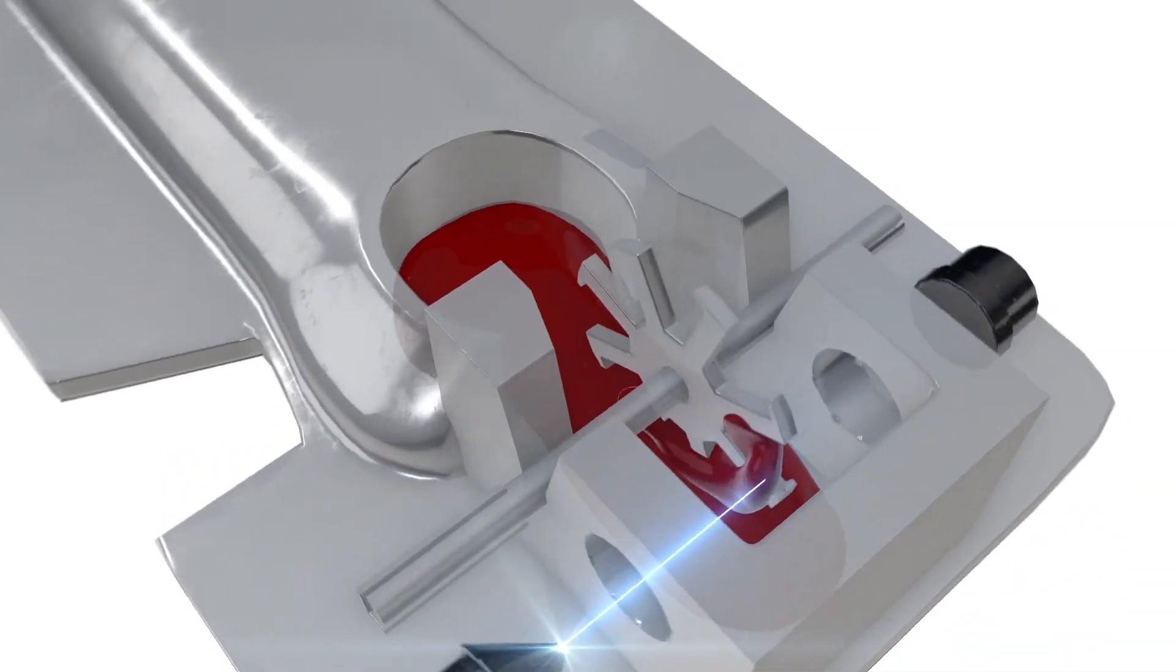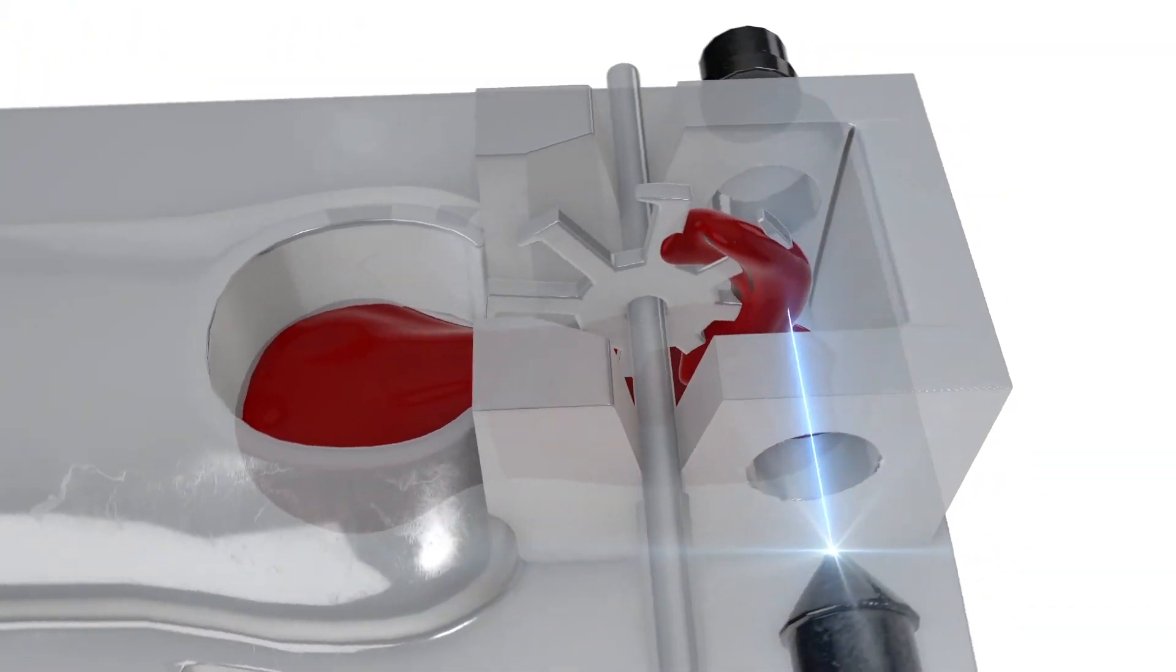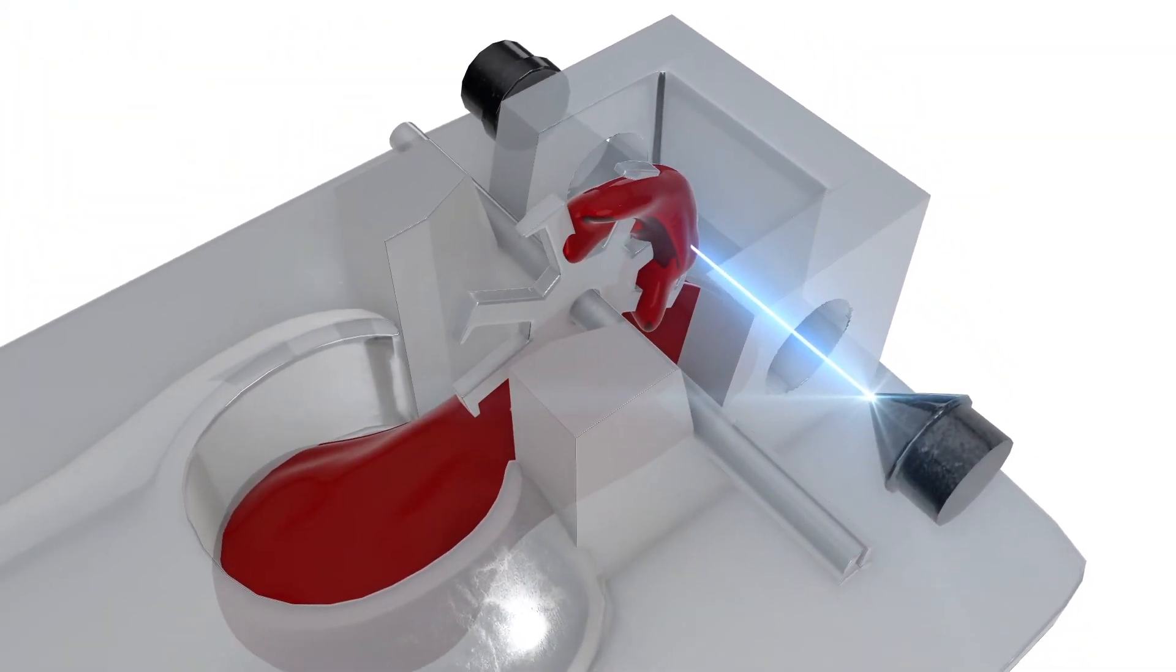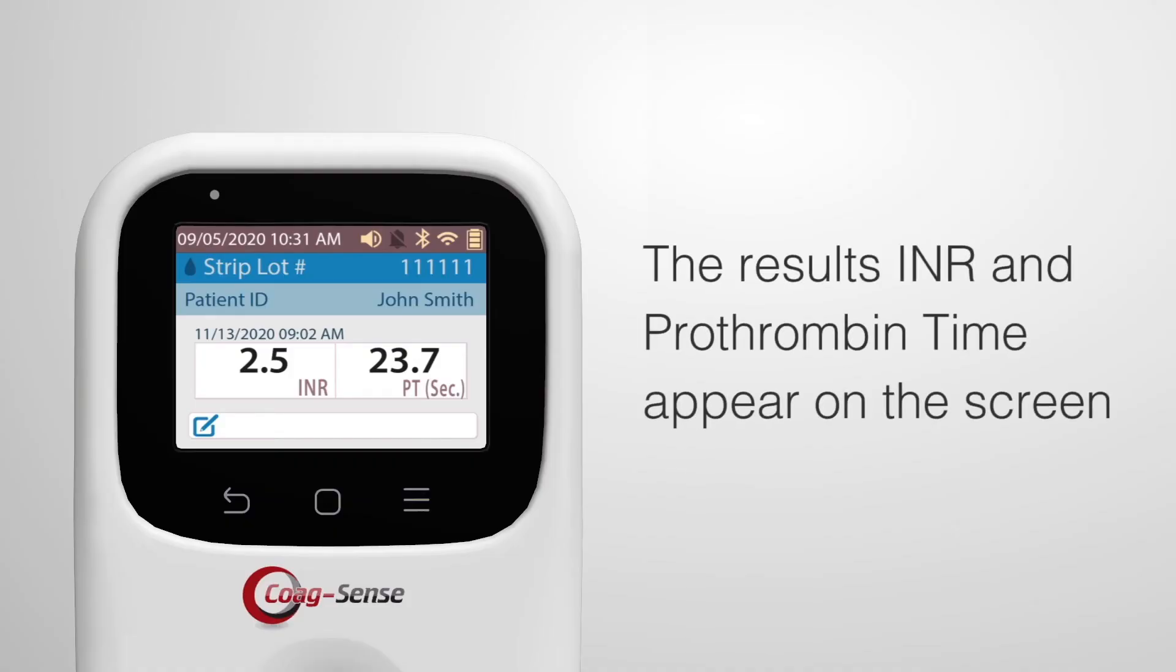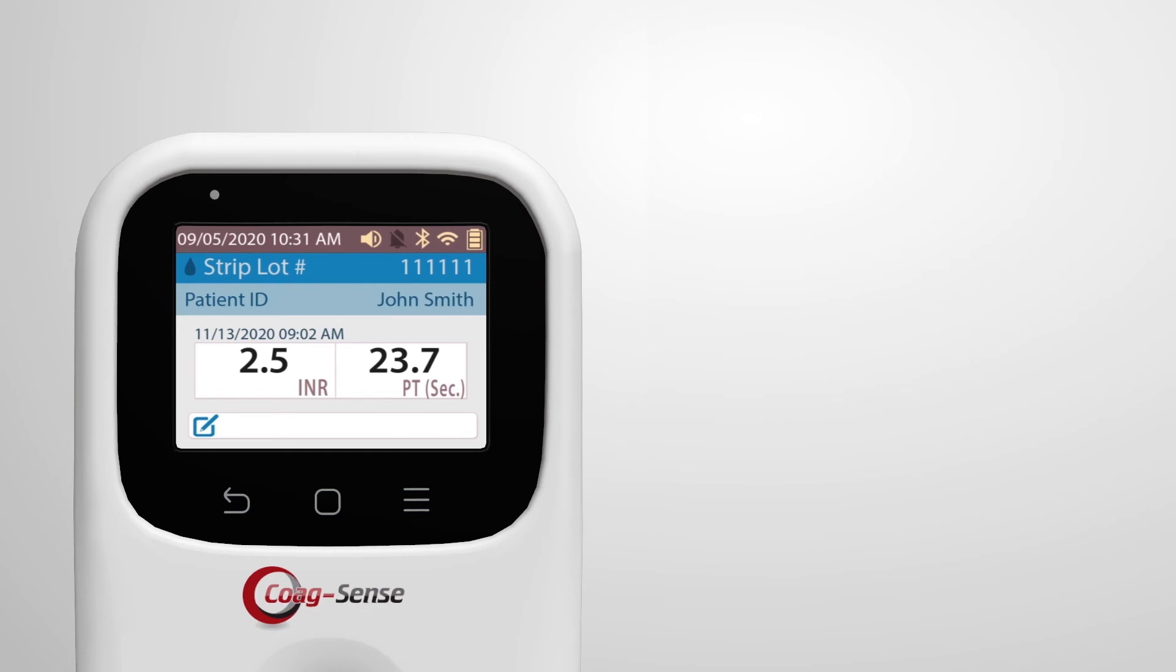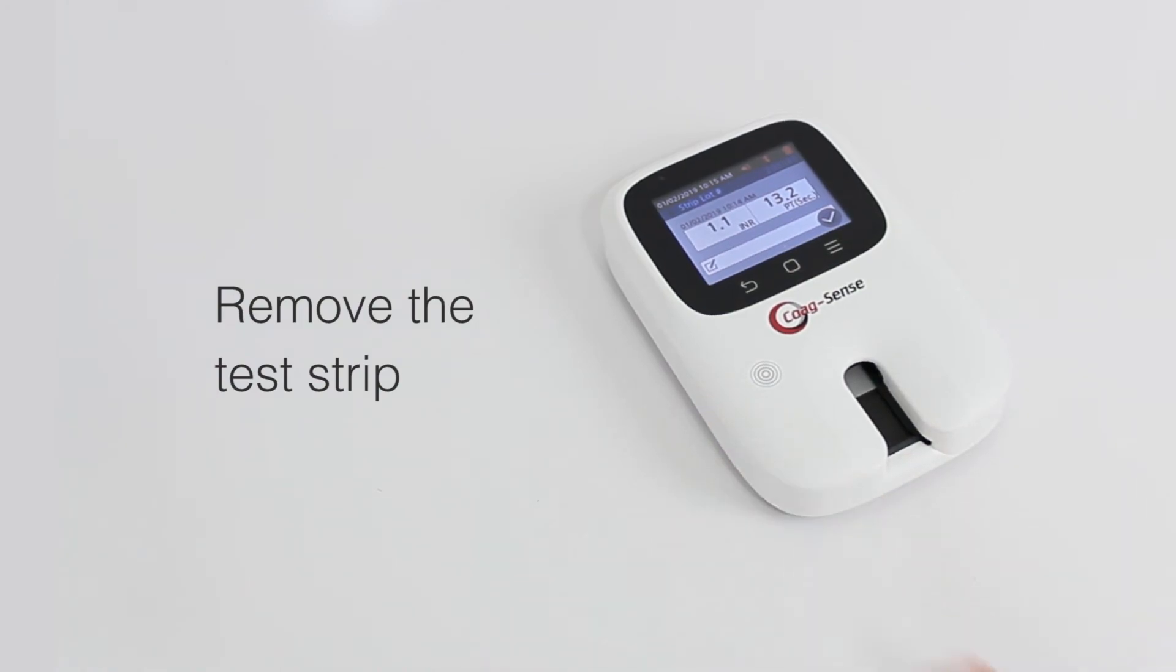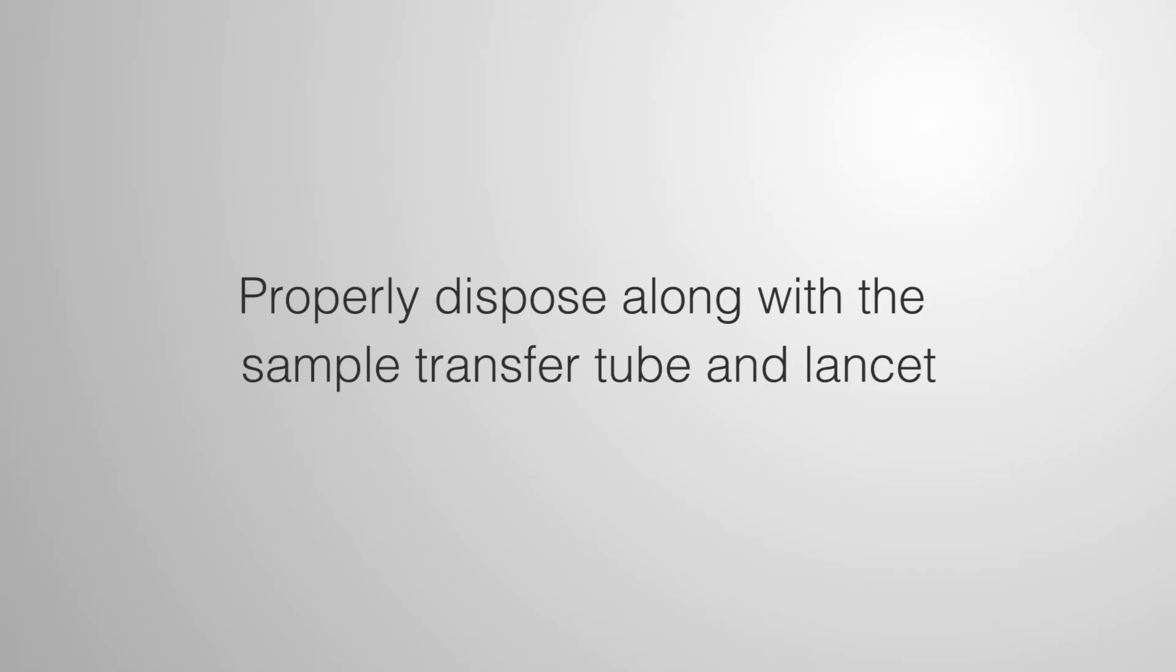When testing is complete, the meter beeps once and the results, INR and prothrombin time, appear on the screen. Remove the test strip and properly dispose along with the sample transfer tube and lancet.